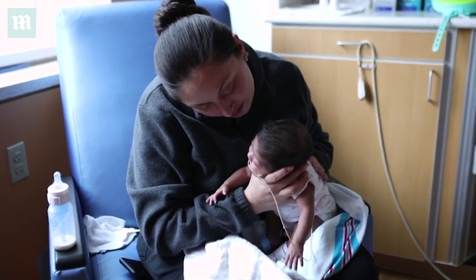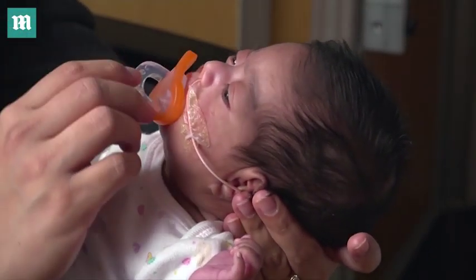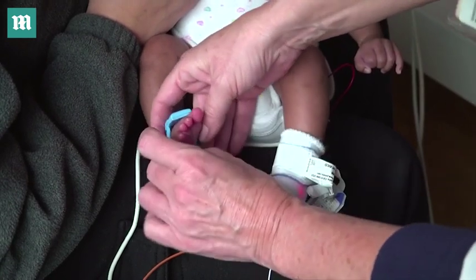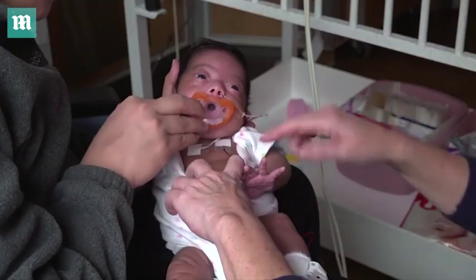They can stand there, but they're so worried about disrupting all of these wires that are so important in monitoring the baby. We've been able to demonstrate that you can, in fact, build very soft, non-invasive skin-like wireless sensors that replicate all of the kinds of monitoring functionality provided with these wired-based, adhesively bonded sensors to the surface of the skin without any sacrifice in accuracy or precision.